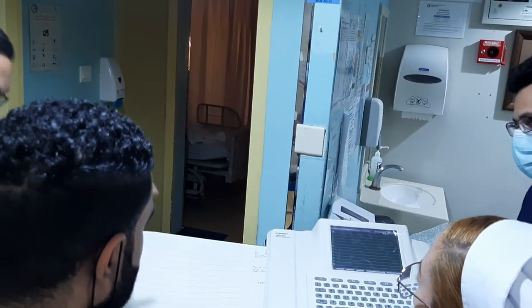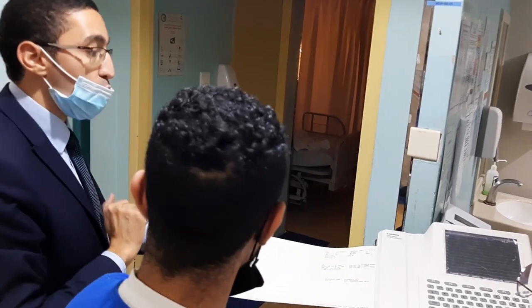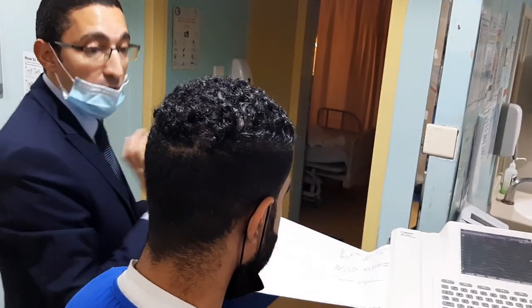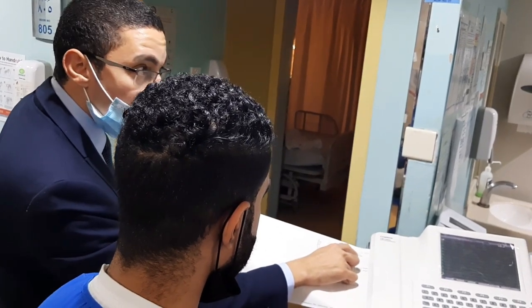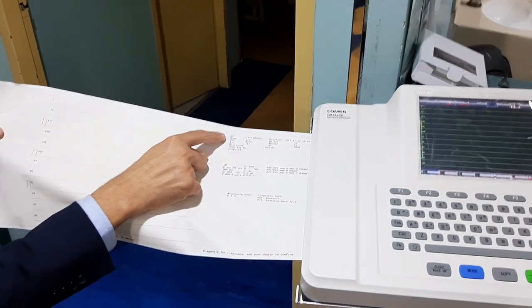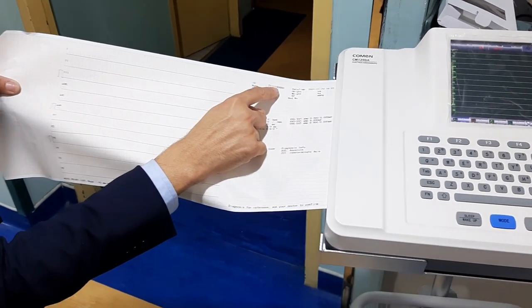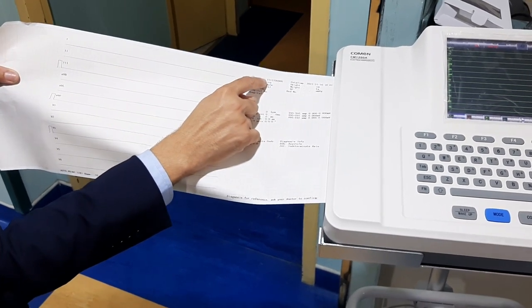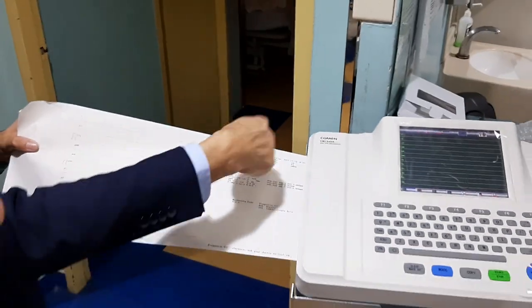I will show to you now about the copy, about how to retrieve previous patient. I will show to you now also. You have many features here. Okay, you can read. Right. The name, it will show the date here. The time will adjust. See, ID number coming by date. Date, 10 November 2021. Patient number 0, then patient number 2, number 1, number 3, like that.